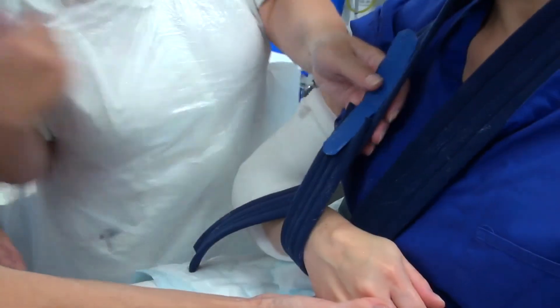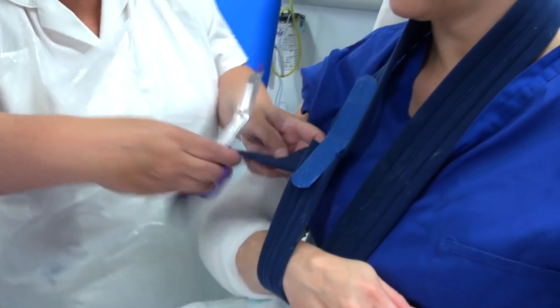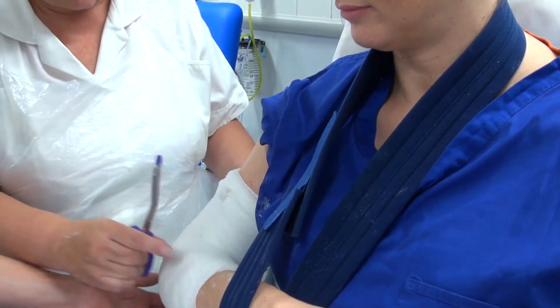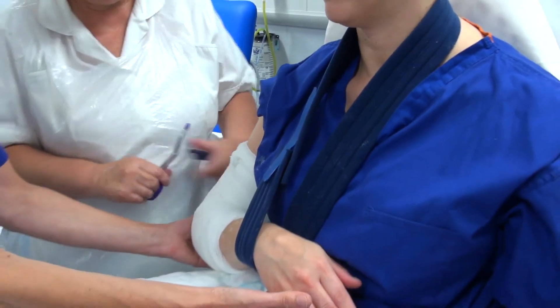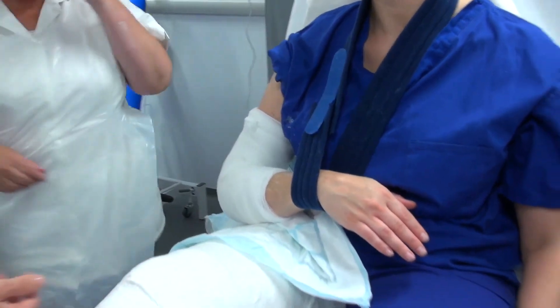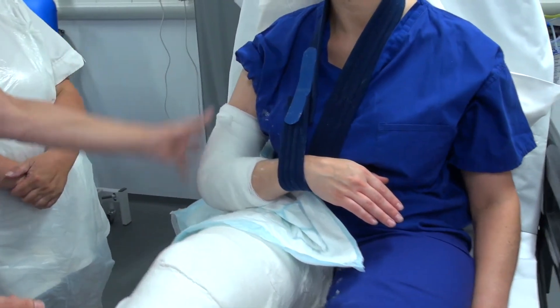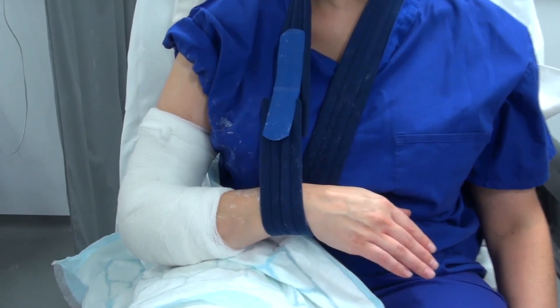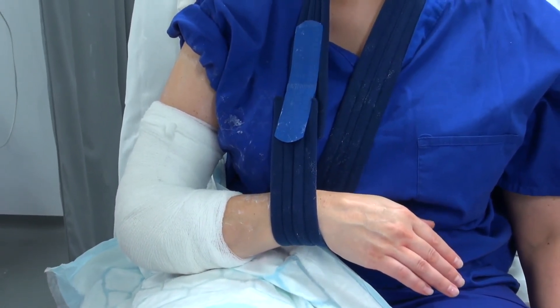To finish off, I'm just going to apply a collar and cuff which will be secured at the wrist. That collar and cuff is going to hold the arm in place, and the weight will provide some traction to allow the humerus to disimpact and to maintain proper alignment of it.